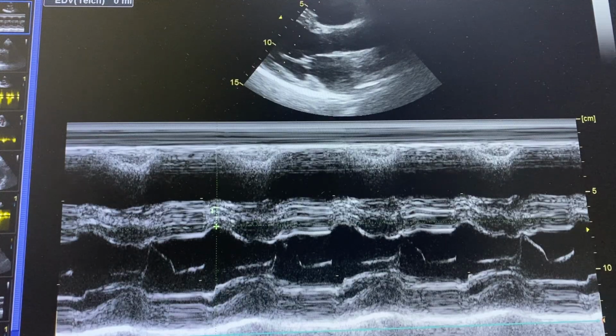And then we go to posterior wall. Remember here in PLAX mode at level of mitral valve, we are going to measure. We can measure EPSS, e-point septal separation, and all that. But now we are measuring cavities and thickness, size of LV.